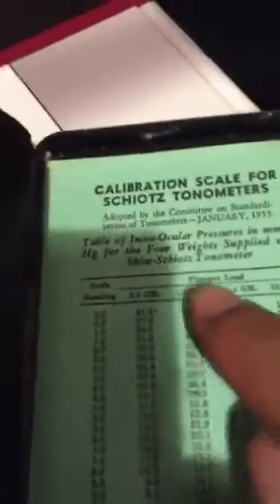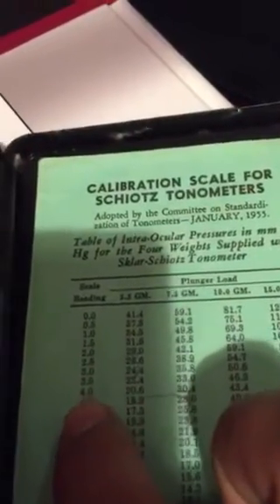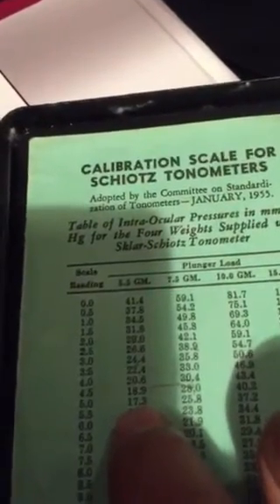Get your device back. Go to your scale. Look which weight you were using — in this case it was 5.5 grams. Look up 5, and the pressure rating is 17.3.